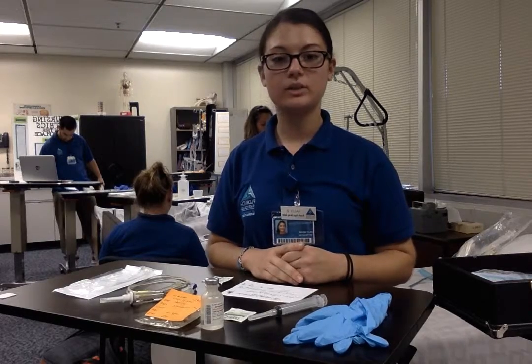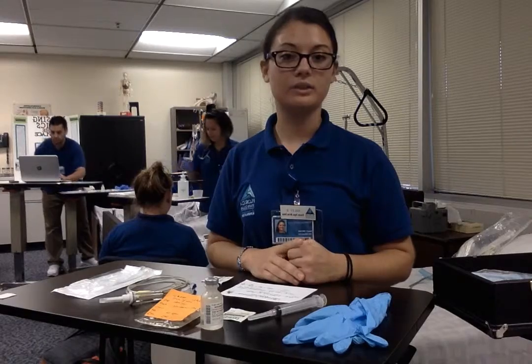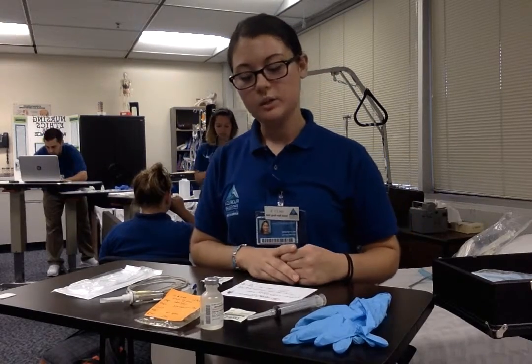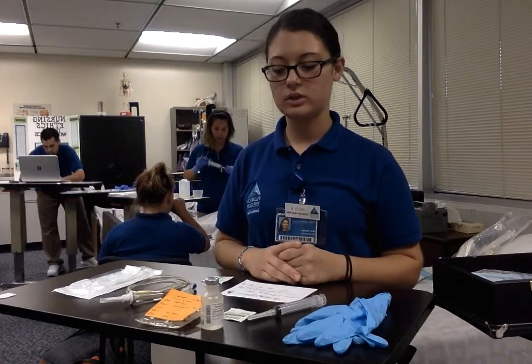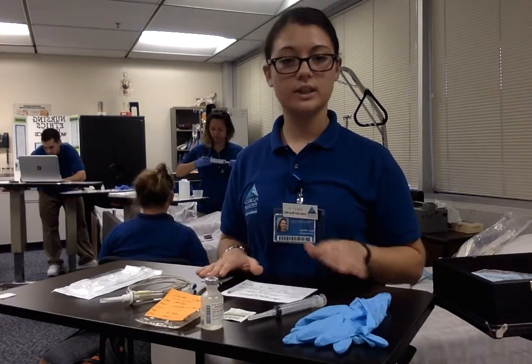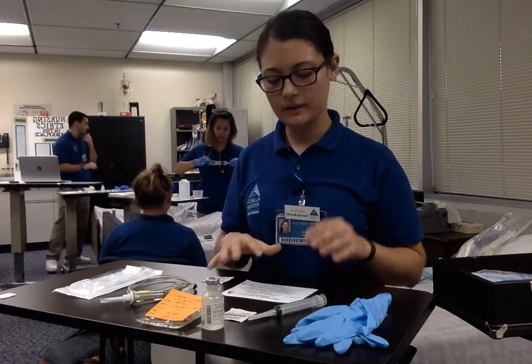Today I'm going to be showing you guys how to do a piggyback when you already have a primary line established with your patient. So first things first, we're going to go ahead and implement standard protocols. I'm going to make sure that I verify my doctor's orders against my MAR to make sure that I have the correct patient and the correct procedure.